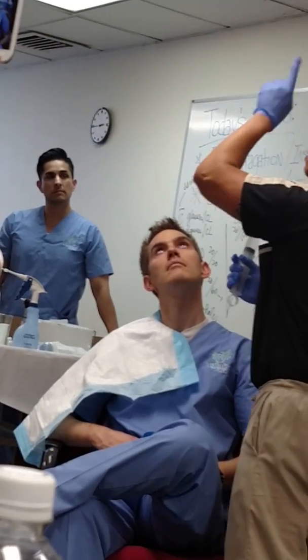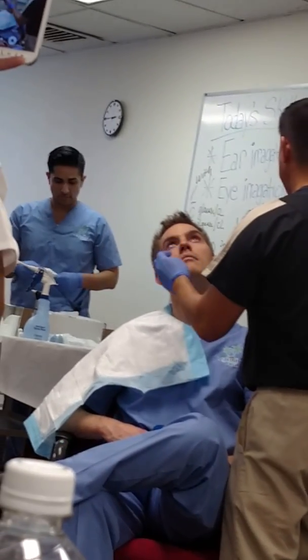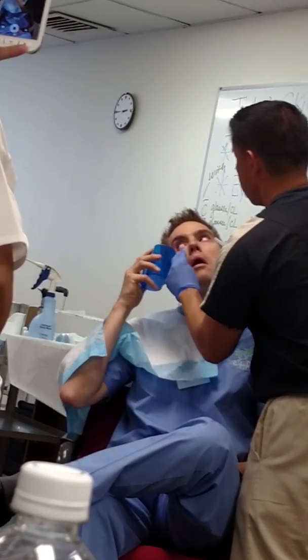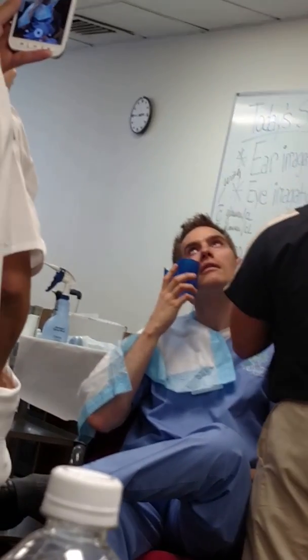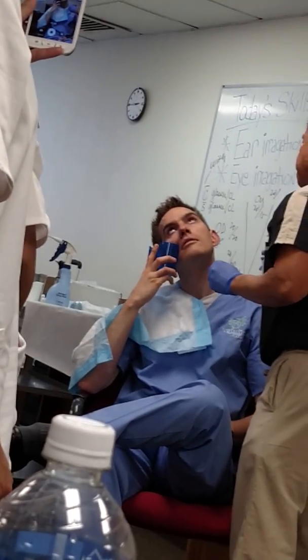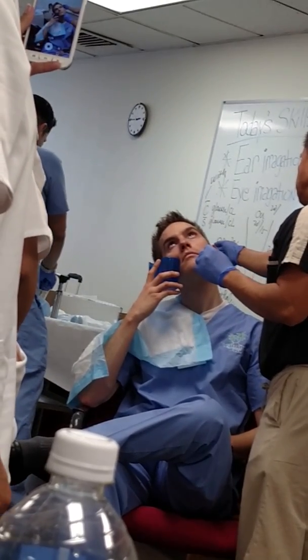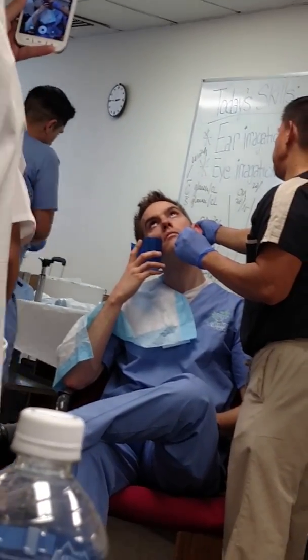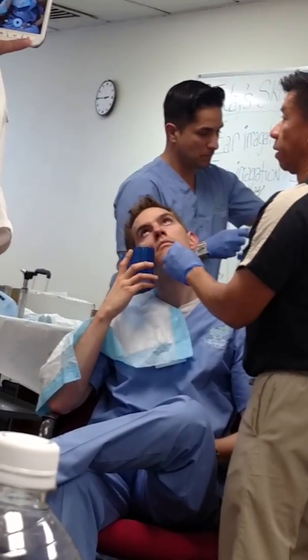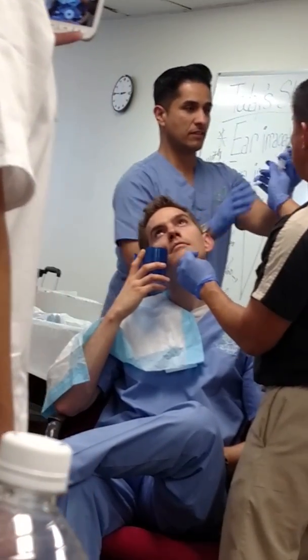Normally in the clinic they have this beautiful picture of the beach or anything, so they'll focus in there. And this is a big one. I need a small syringe. Okay. Help. Thank you. You put a tip. This is like a real thing. Give it a tip. The patient is like my fish waiting.